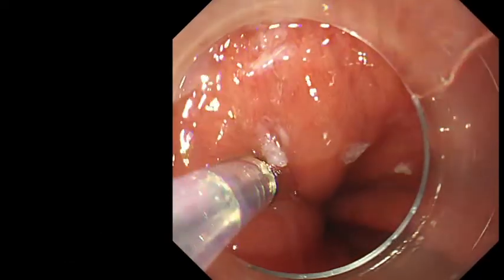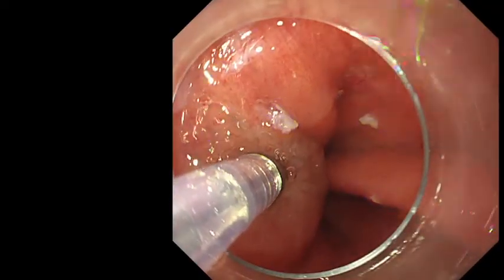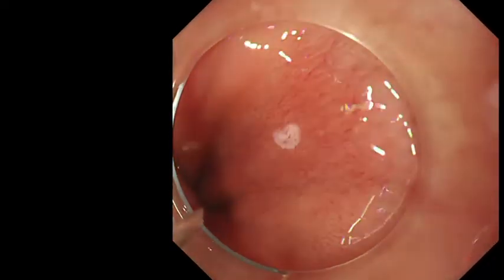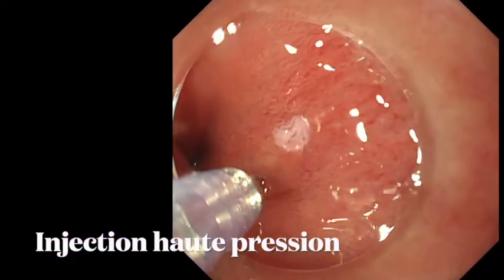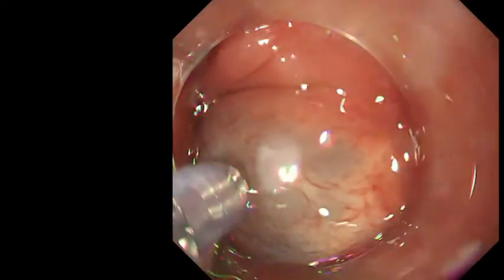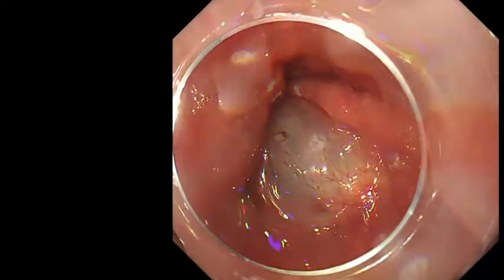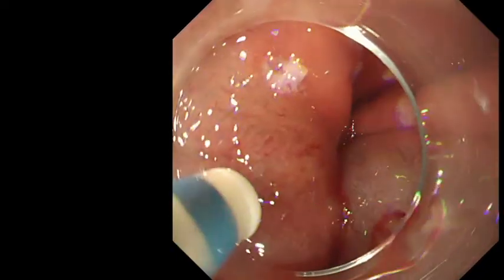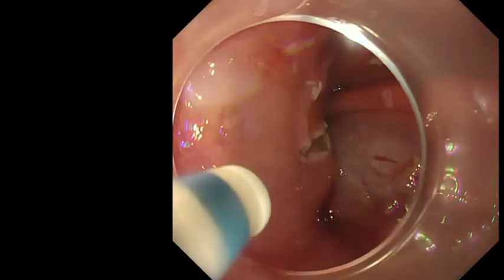On the left, we will inject without pressure. I mean, I ask the nurse to inject, but slowly. You can see that the elevation is good, but not very strong, and the mucosa is not very thin because there is no pressure under. But if you inject strongly, here you can see a small bubble of air, which is not a good thing, but after I ask her to inject very strongly, and here the mucosa becomes very thin, very easy to cut.